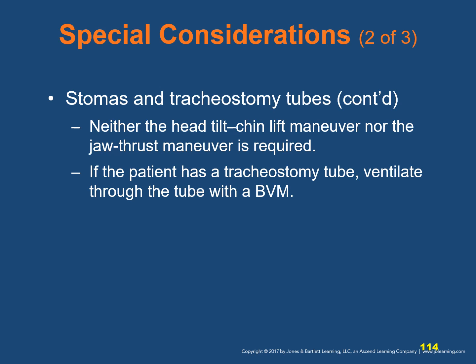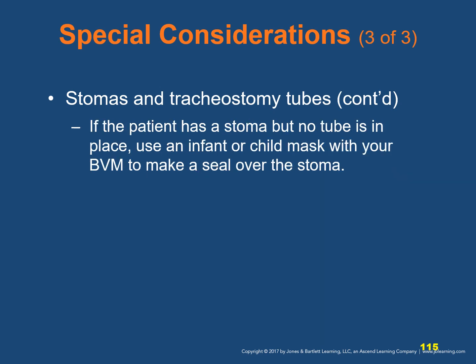If the patient has a stoma but no tube is in place, use an infant or child mask with your BVM to make a seal over the stoma, as I just said.